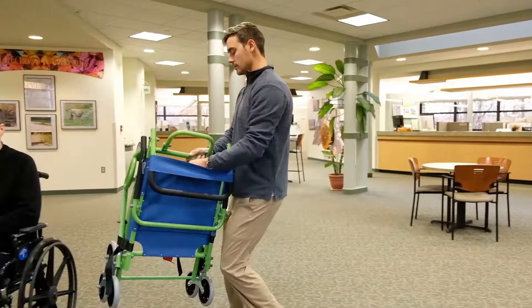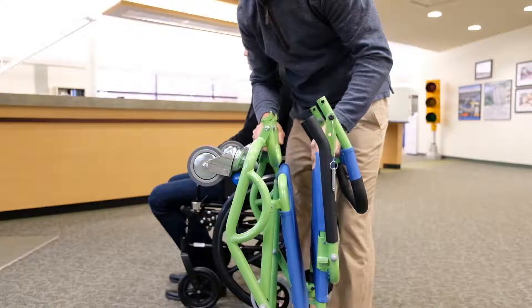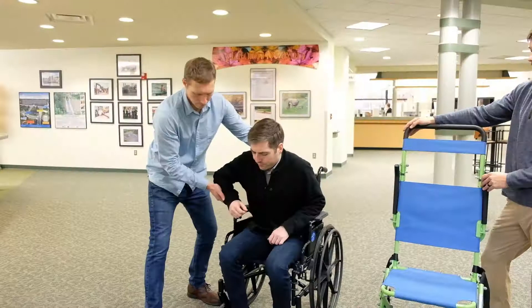Begin by removing the chair from its storage location and placing it on the ground. Next, undo the safety belt and let the straps fall to the sides. Unfold the seat and lift the handle upright, inserting the safety pins into each side to secure it in place.